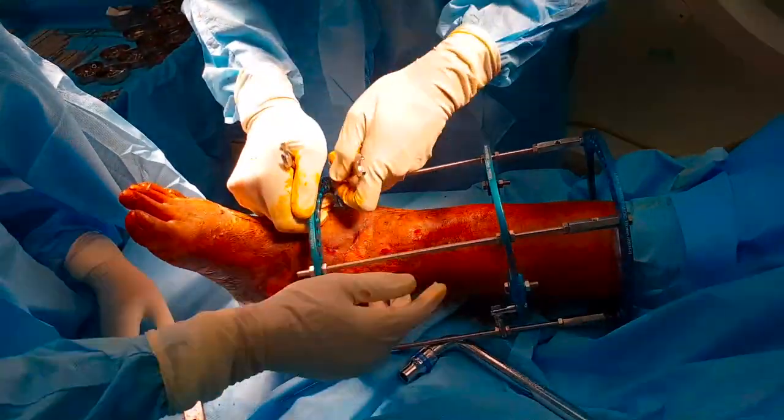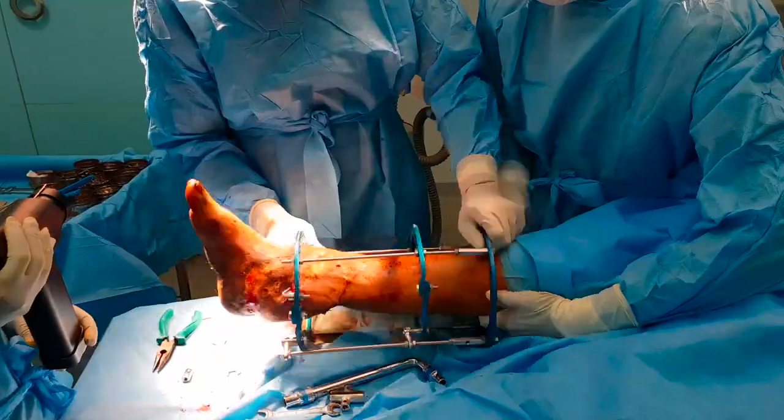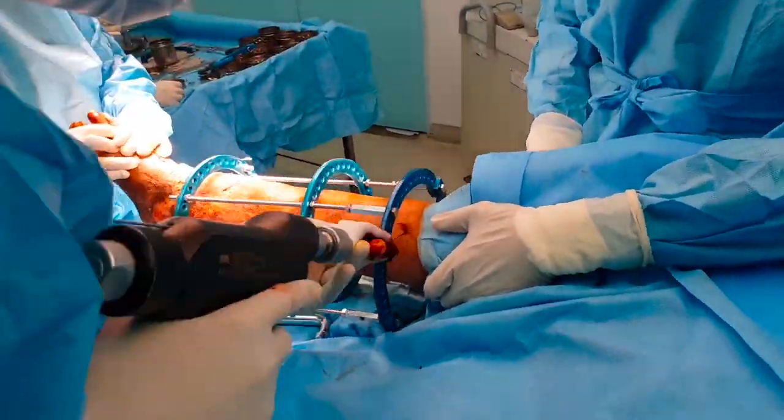The other end is pulled to tension using the Russian method. As the nut is twisted, the wire stretches. The wire is now tightened. We can see that the gap posteriorly is more than the anterior gap.